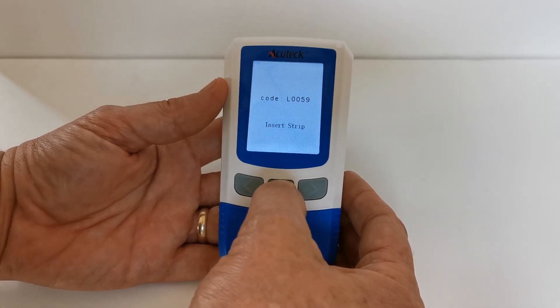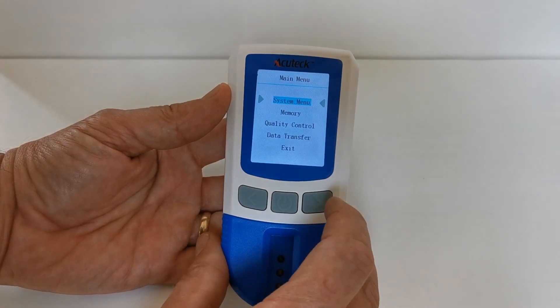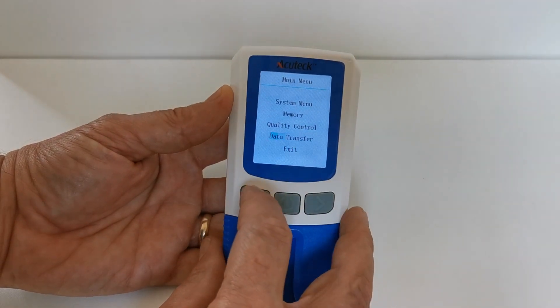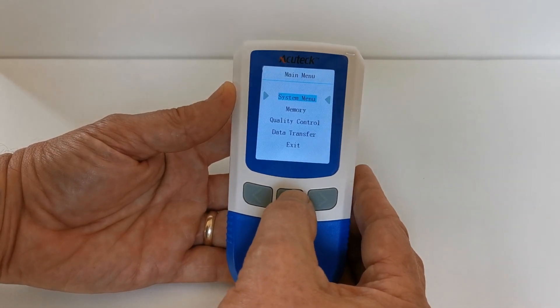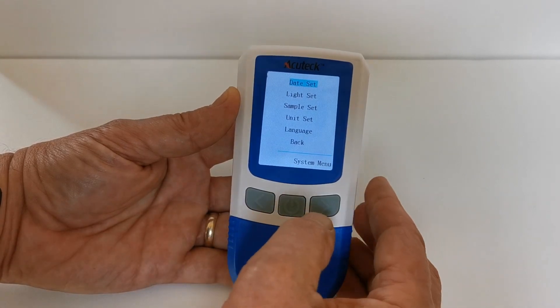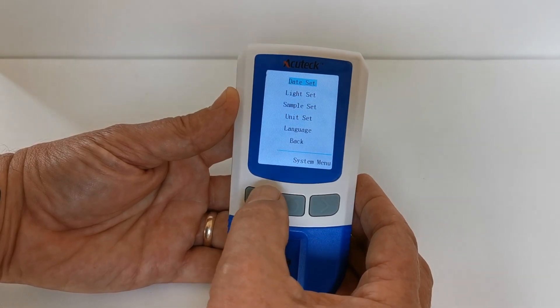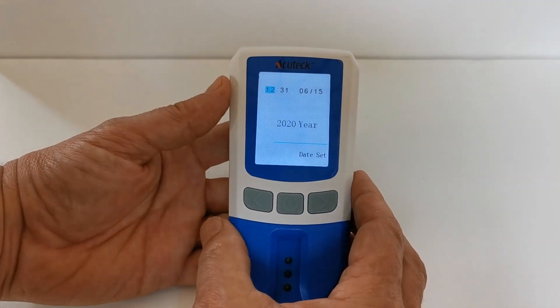But first, I want to show you how to set the time and date. Hold down the power-on button and you'll see it brings you through to the system menu. You can navigate through the various elements, and if you press the power on/off button again, it will bring you through to date set. Navigate using the side buttons up and down through the different menus, and when you're on the one you want — date set — press the power-on button.